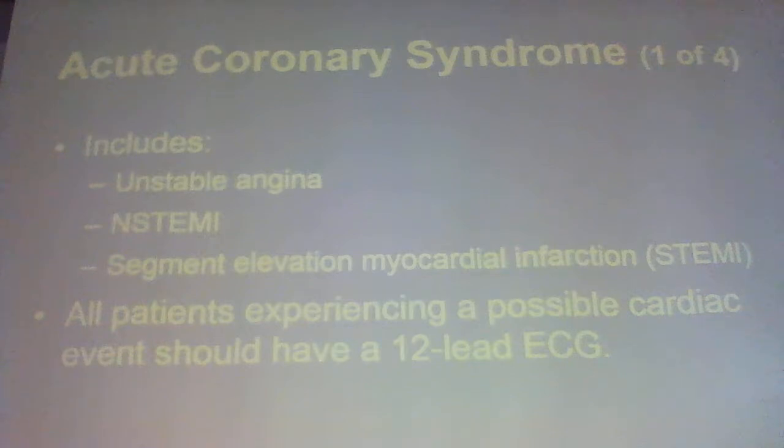That's why I harp on you guys to take the monitor in. Do it in the living room, do it in the kitchen, do it in the bedroom. Don't wait till you get in the back of the ambulance. Okay? That's a 15 to 20 minute delay in getting a 12 lead. Not good.